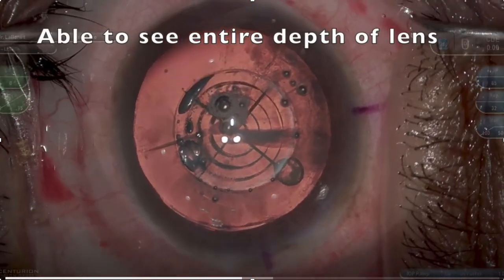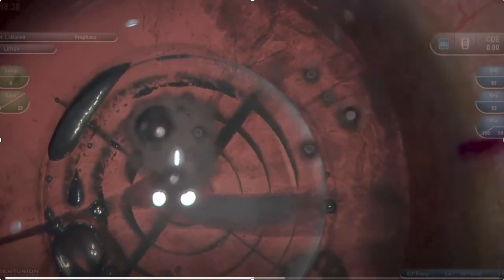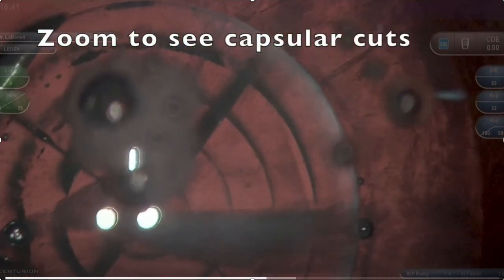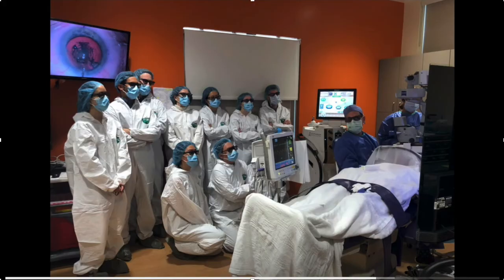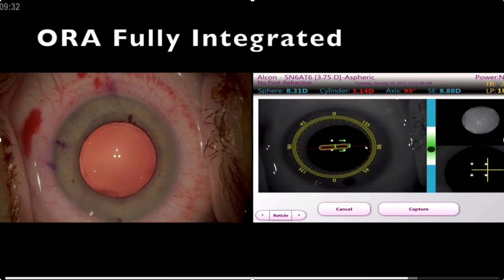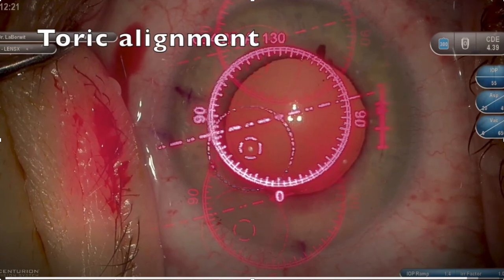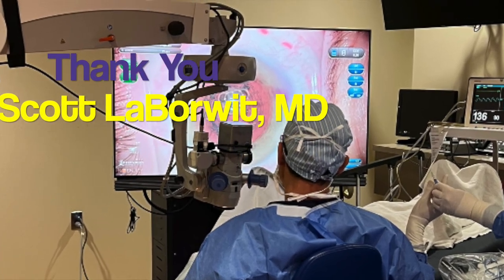I keep emphasizing the ability to see the entire depth of the lens. You can see the anterior capsule cuts, but you can also see the air bubbles posteriorly as well. It's a wonderful teaching tool — I teach a femtosecond laser cataract surgery course, and here are several third-year residents watching a case. The AURA is also fully integrated, and I can use it for toric alignment on the monitor. Thank you, and I hope you can use this information in your practice as well.